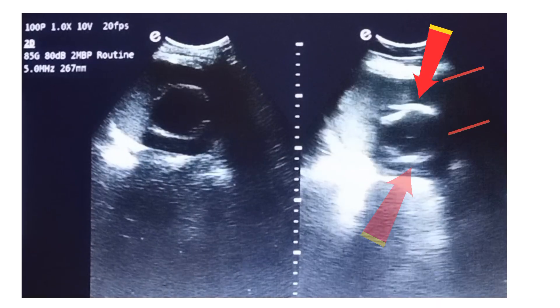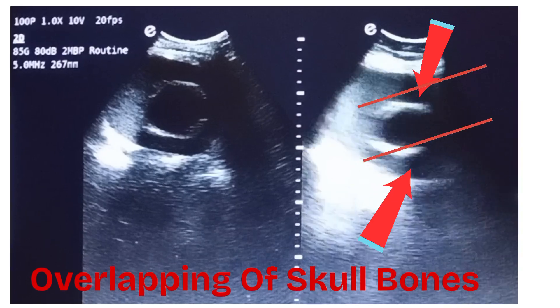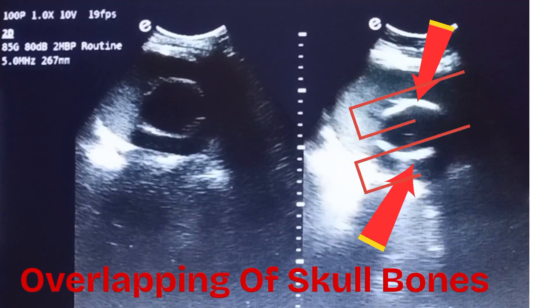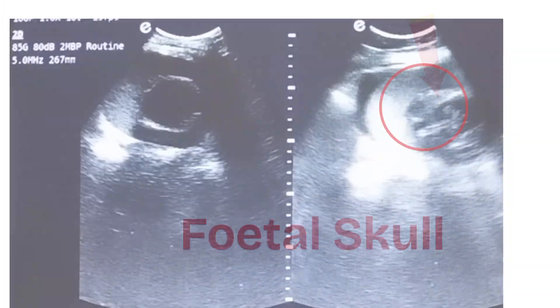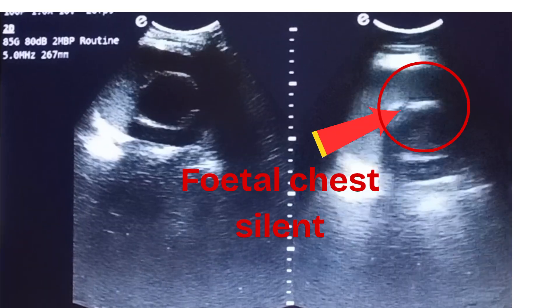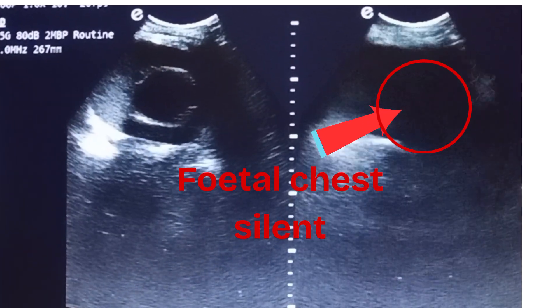This slide is very important. Here you can clearly see the fetal head skull bones overlapping, with arrows indicating the points of overlapping. Inside the red circle, the silent fetal chest can be seen.